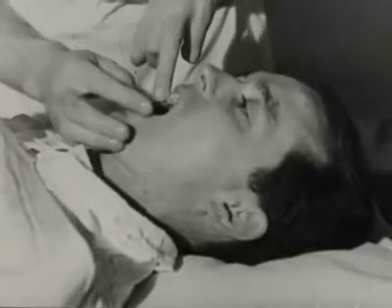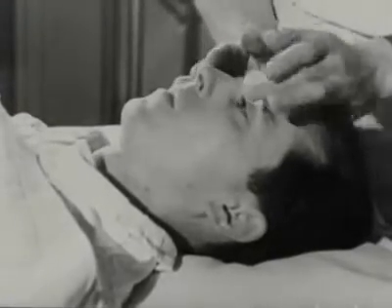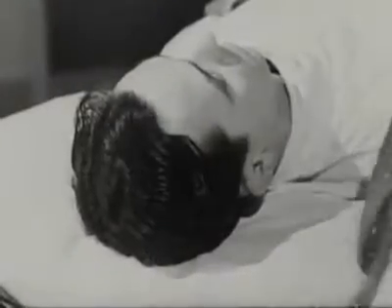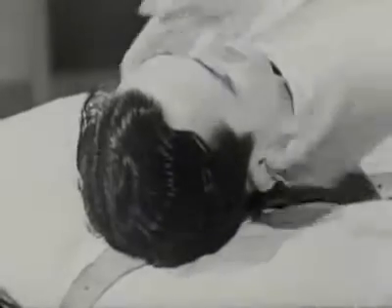Examine his teeth and see if there's any obstruction to nasal breathing. Place the harness beneath his head to be ready in position when it's wanted.